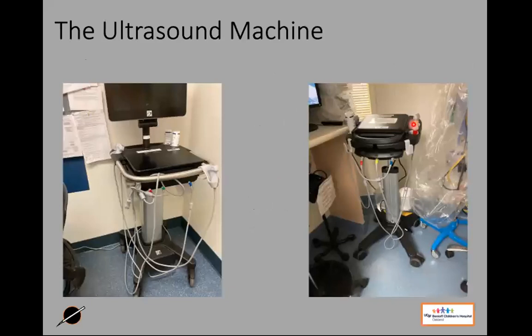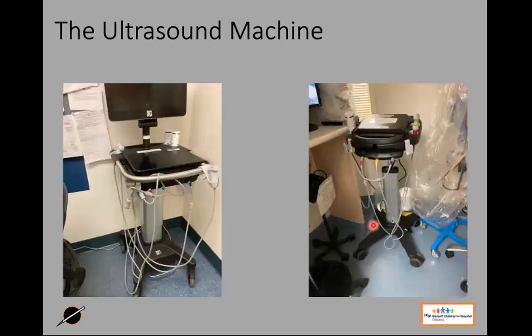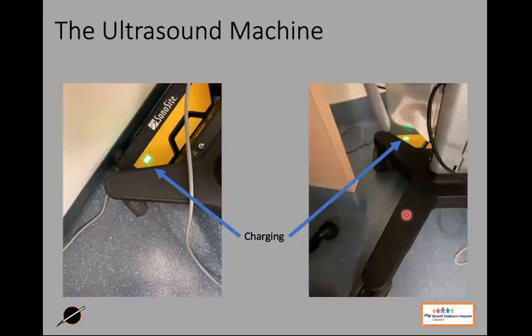Okay, in our department, we have two machines. We've got the big one that lives in the attending's office, and we've got the smaller one that lives in the anteroom between trauma 1 and trauma 2. This is a personal pet peeve, and the more you do ultrasound IVs, this will become one of your pet peeves, I hope: not charging. You go in to grab a machine and the machine is dead. So when you're putting things back in their rightful place, way down here at the bottom, there's a charging dock there and a charging dock there. Please plug those machines back in. And make sure that the machines are clean too.